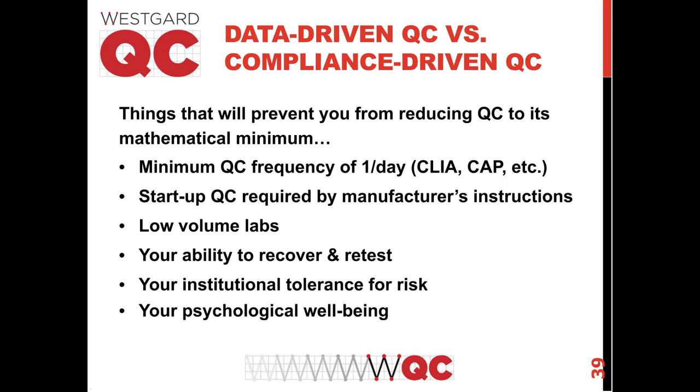And finally, there's your psychological well-being. Can you sleep at night if we reduce your QC down to once per 1,000? If you're not going to be comfortable with that, we're not going to force you. This is an option.